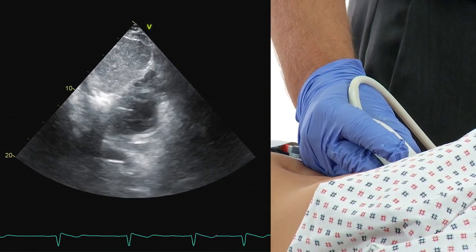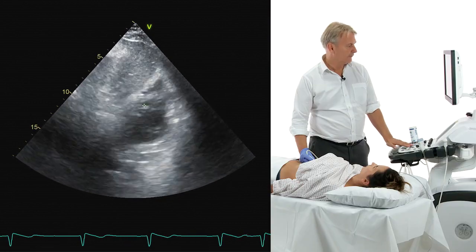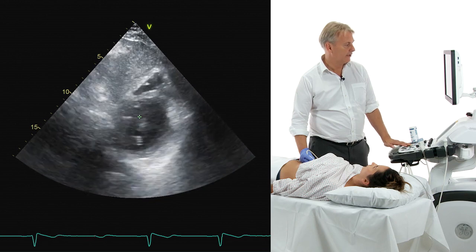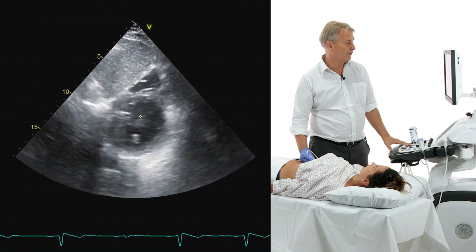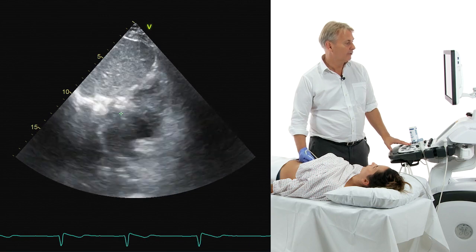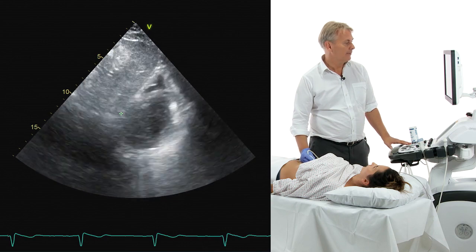Now, this short axis view looks very much like the parasternal short axis view, with the right ventricle right here and the left ventricle right here. So here you can actually assess circular or radial function of the left ventricle. And you can scan the ventricle by going back and forth from the base to the apex.